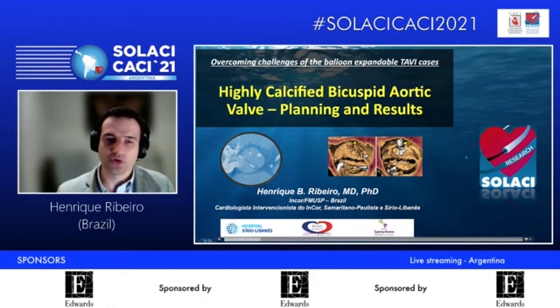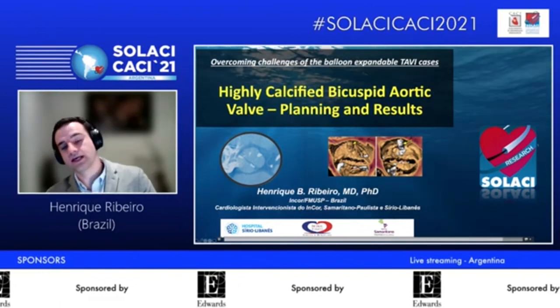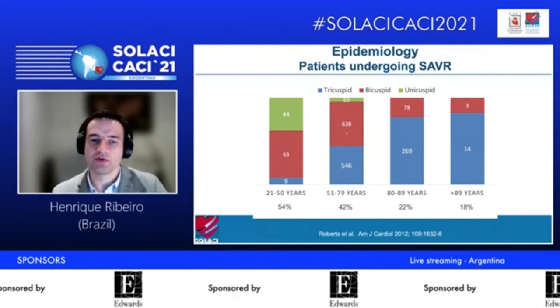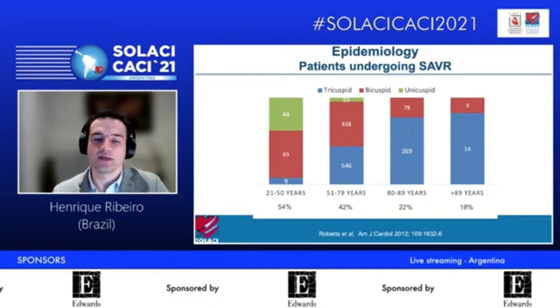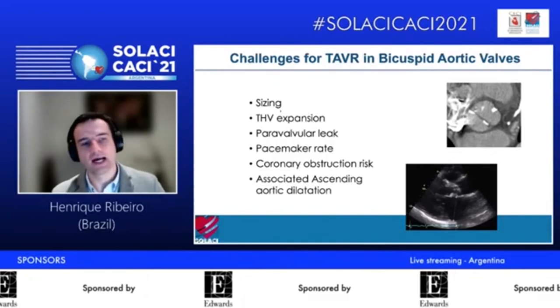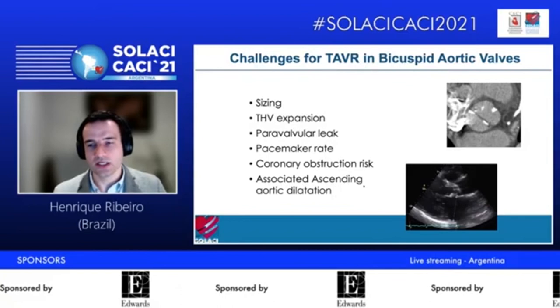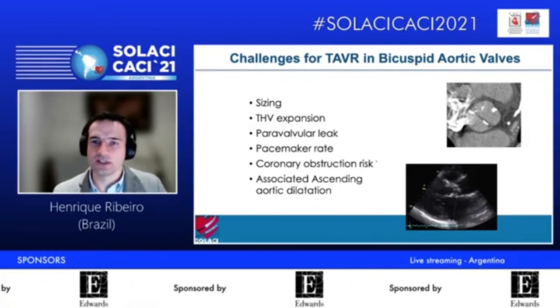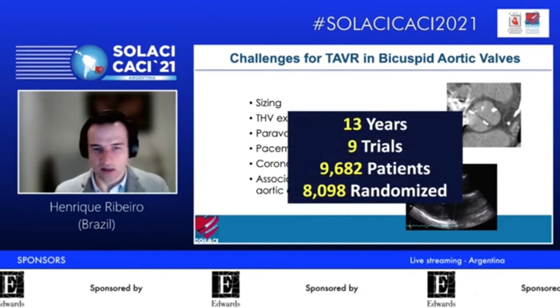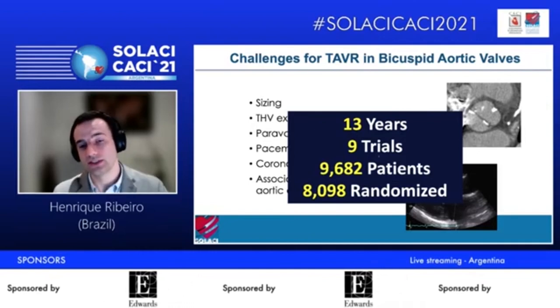And we are really behind the schedule, so I'll try to be brief, discussing some very important aspects regarding bicuspid valve. First of all, while we are treating patients with less age, of course, the incidence of bicuspid valve is going to increase. So many challenges and important aspects should be evaluated in such patients: sizing, THV expansion, paravalvular leak, pacemaker, ascending aorta dilatation. So many different challenges for TAVR in such patients with bicuspid aortic valve. In addition to the fact that after more than 13 years, 9 to 10 trials, and more than 8,000 patients randomized.